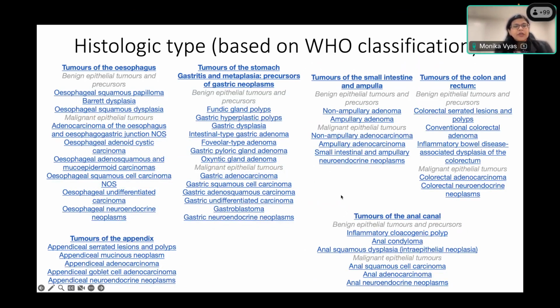If you see a deviation from normal histology of adenocarcinoma, it's best to go back to the book and see if your morphology fits into any of the other categories better. And when you're obviously trying to give a rare histologic subtype, it's good to have immunohistochemical support, or show it to multiple colleagues and arrive at a consensus. So here are some examples.